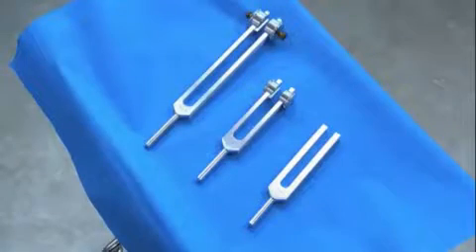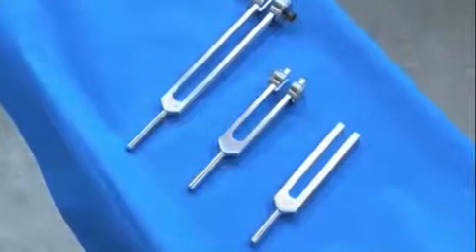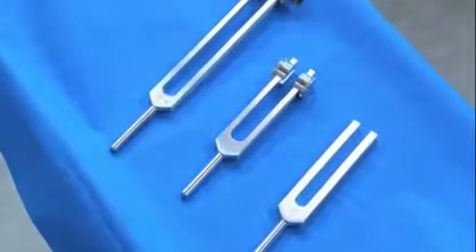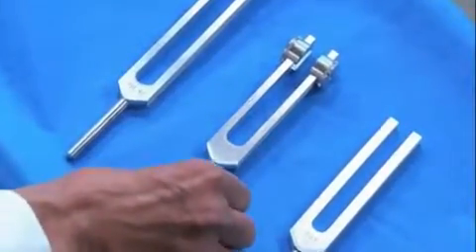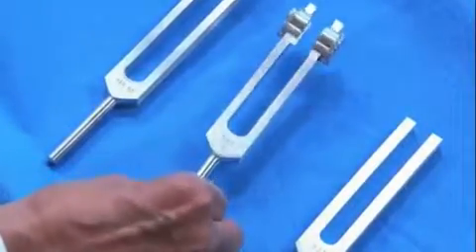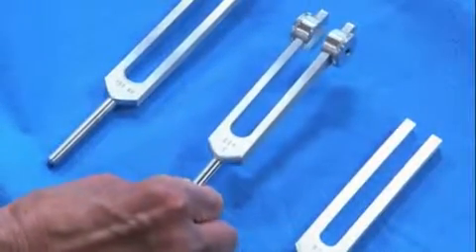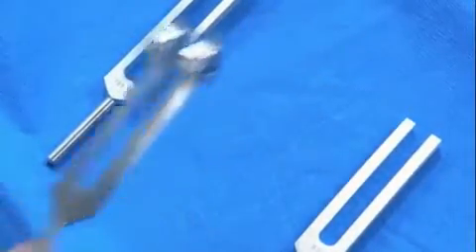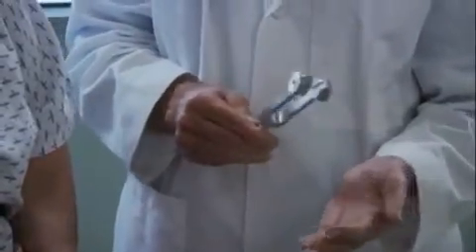For patients failing the whispered voice test, a tuning fork test helps determine if the hearing loss is conductive or neurosensory in origin. In a quiet room, select a tuning fork of 256 or 512 Hz, as these frequencies fall in the range of conversational speech. Set the fork into light vibration by tapping it on your hand. Test for lateralization by performing the Weber test.